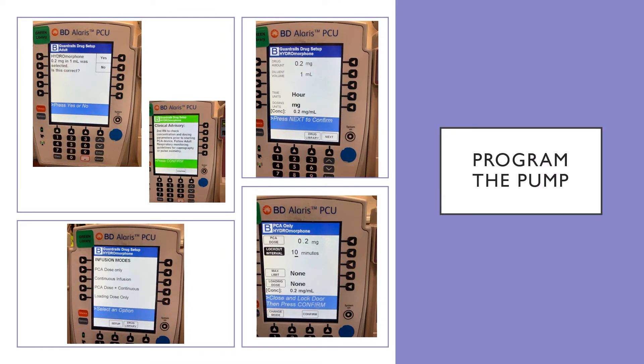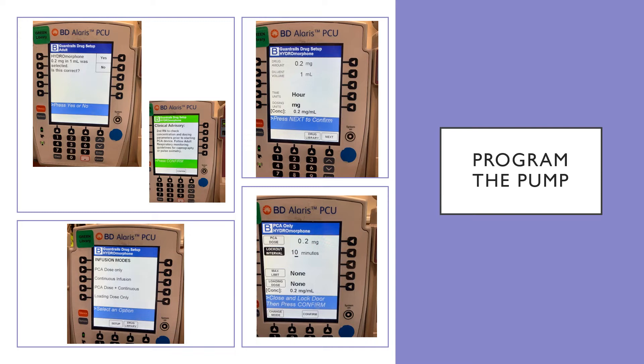Here are screenshots of programming the pump. You pick the medication. Second, there'll be a clinical advisory where you are requested to have a second RN check. Confirm at the bottom. And then you'll see the setup again and you confirm. The next thing you do on the bottom left is pick the infusion modes. Usually on 11 Tower we're using PCA dose only. And then we need to program the lockout interval. And our usual is 10 minutes.